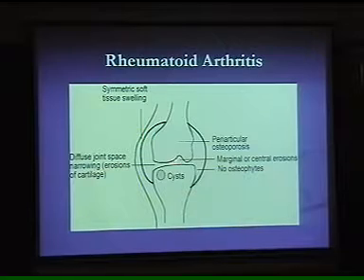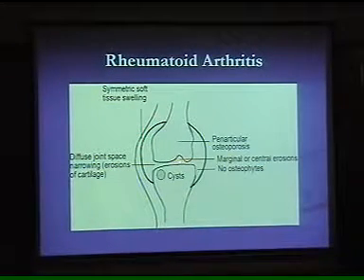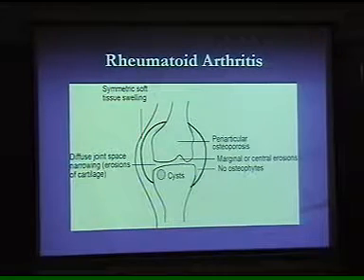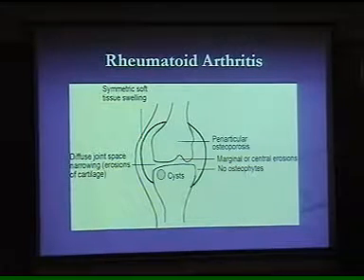There are going to be cracks in this articular surface. Because of the cracks, there is a massive amount of fluid over here. This fluid starts getting into it. So number one, it's going to cause erosions, which I'll show you. Second thing is this fluid starts going down, and these are going to produce cyst formation.